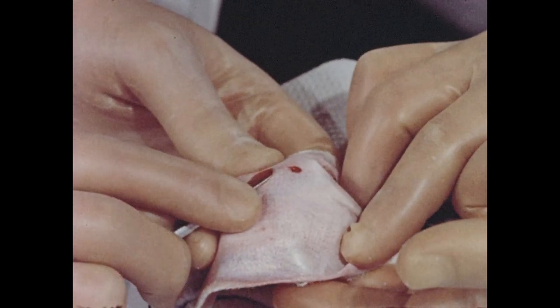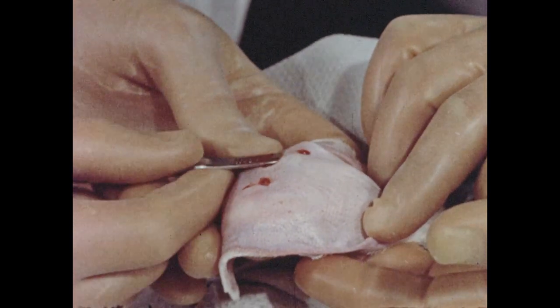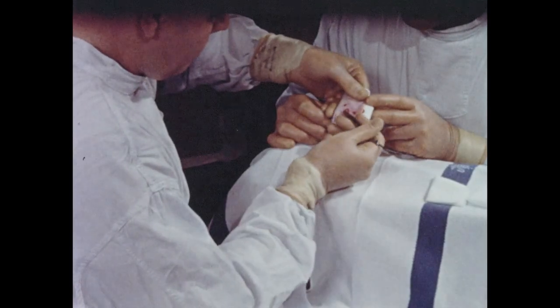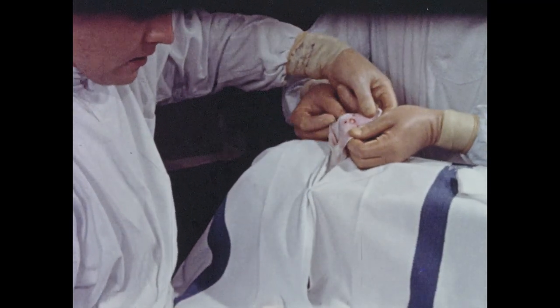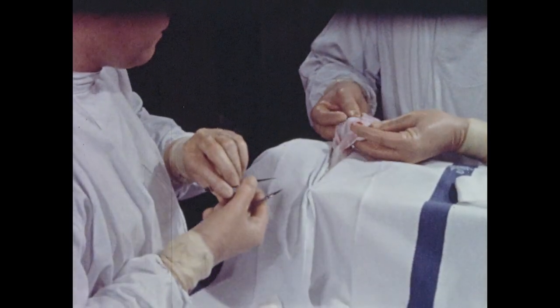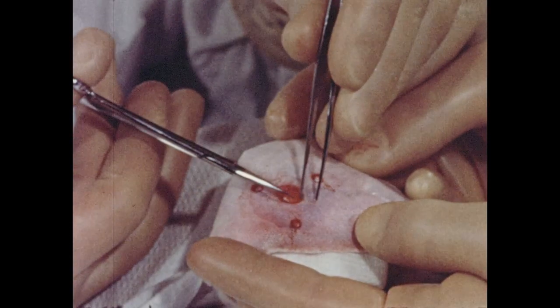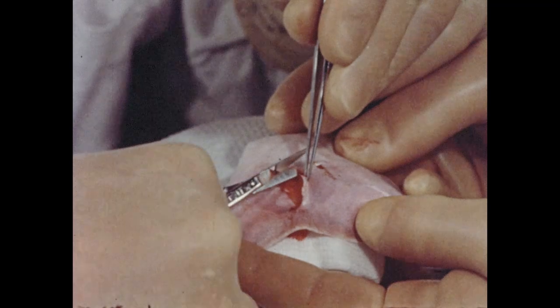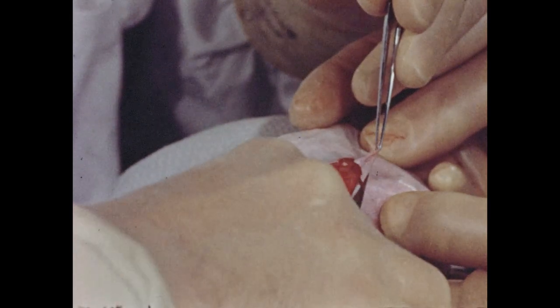By meticulous blunt dissection, a circular area of skin measuring approximately 30 millimeters in diameter is also freed from the inner surface. This dissection should be extended about two millimeters beyond the holes for the three supports. Care is taken to preserve the cartilage, for it alone will support the chamber. By sharp dissection, the skin is completely excised from the area into which the plastic ear chamber will be inserted. Caution should be taken so as not to cut the exposed cartilage.